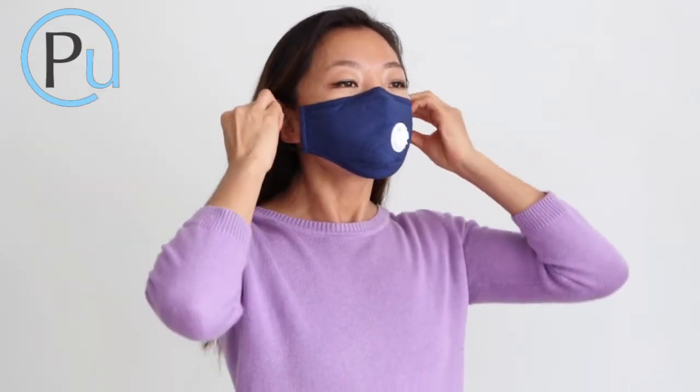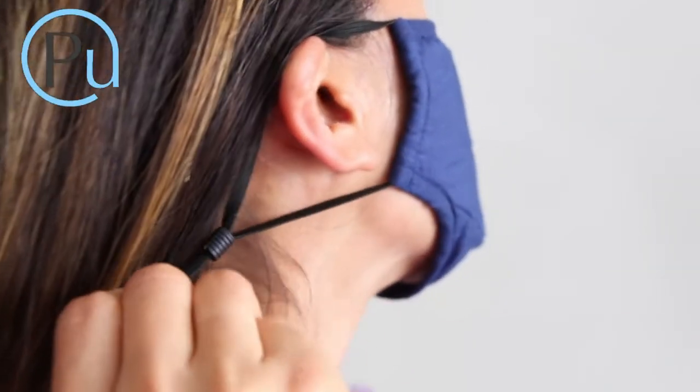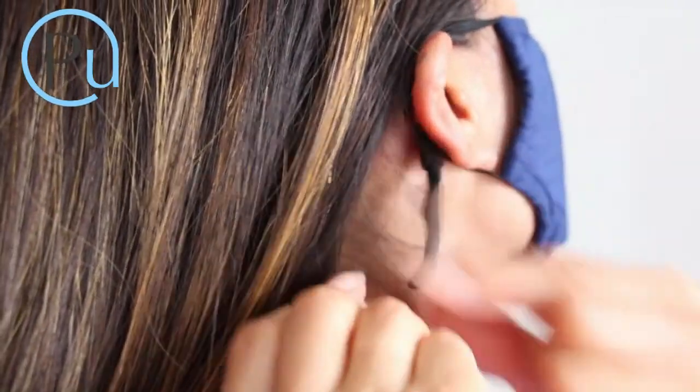Before going outside, put the mask on over your nose and mouth. Adjust the strap for a fit that's snug but comfortable.